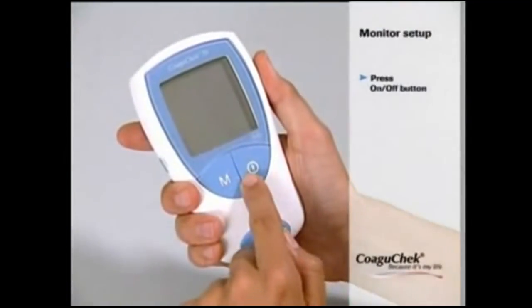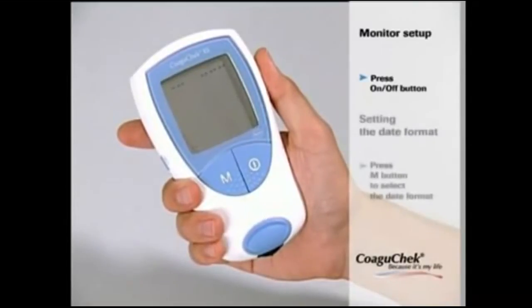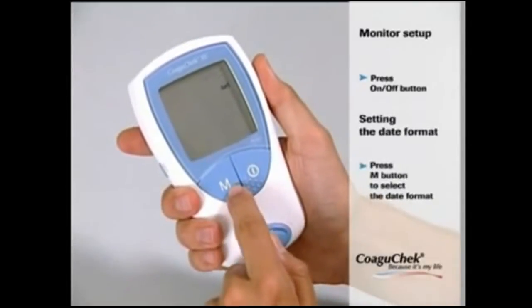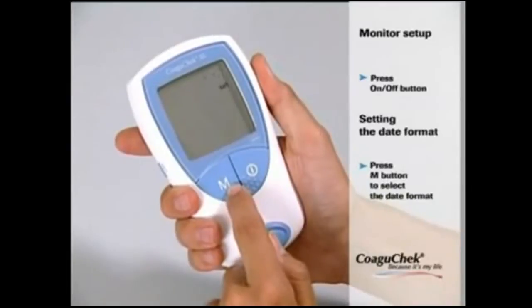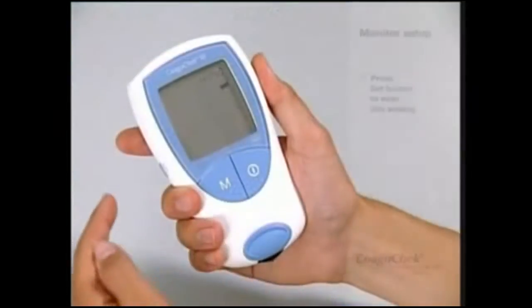Now you can turn on the monitor by pressing the ON-OFF button to enter the setup mode. First select the date format. Press the M button to select the desired date format, and save your setting by pressing the SET button.